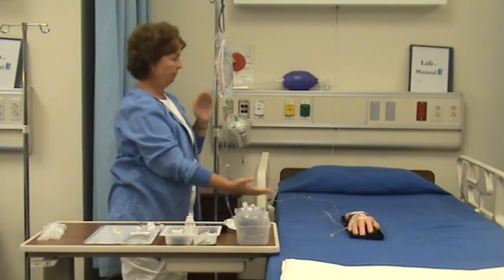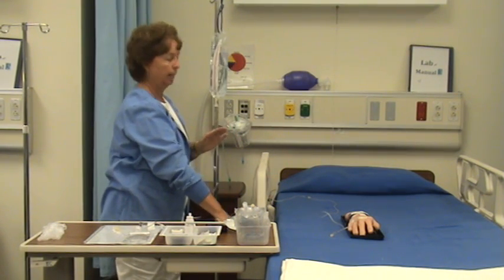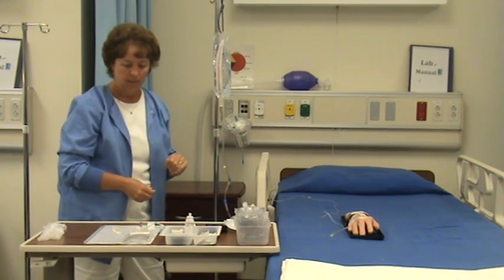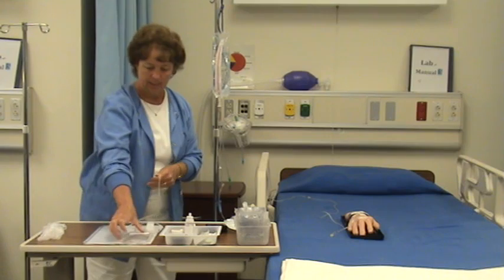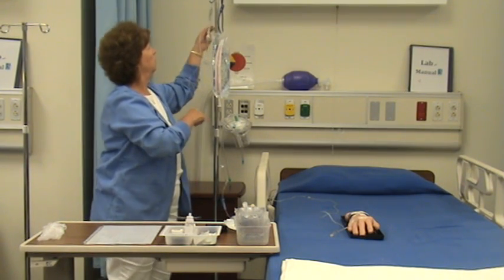Now, of course, for demonstration purposes, these are real close. In reality, this would be down flat and the bag would be higher. But just to get them in the video, that's why it's like that. And now I'm going to hang my secondary medication. So this is going to be at the highest level.